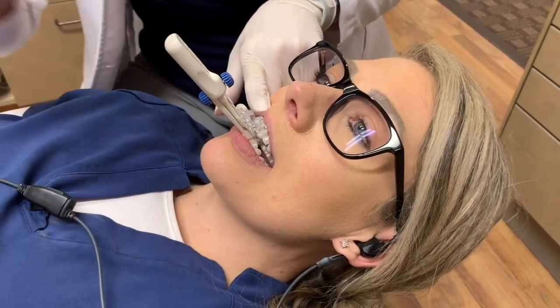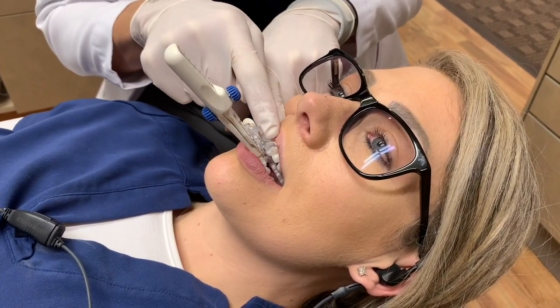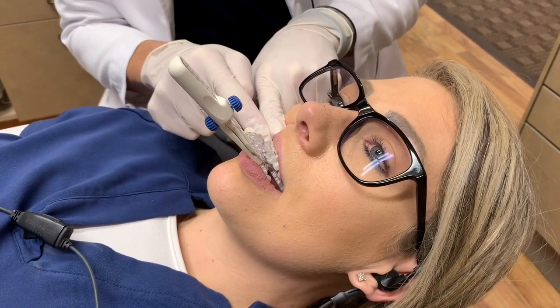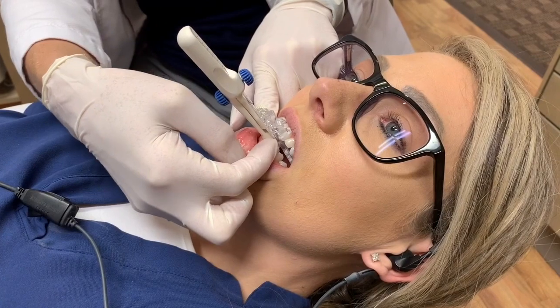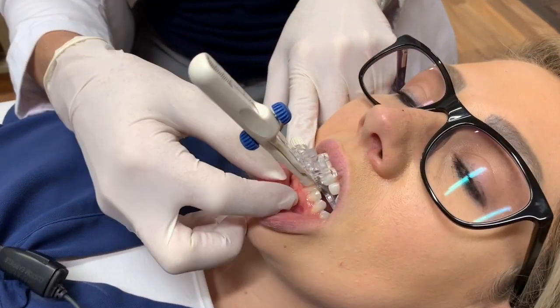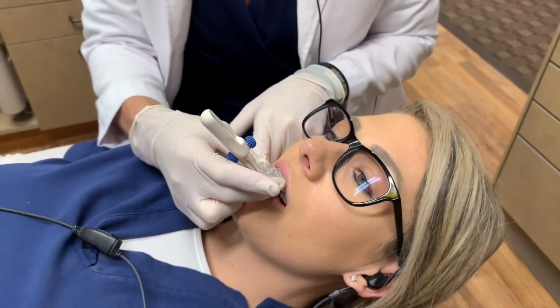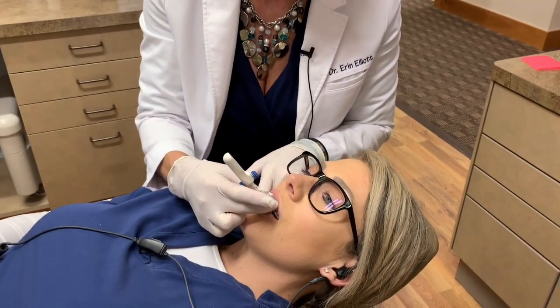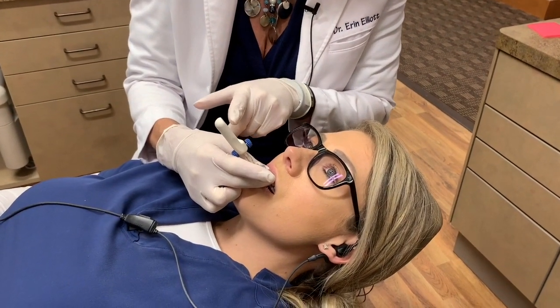I scoop the fork into the mouth and line it up. The midline here is midline to the face, not necessarily the teeth. I make sure the lower anteriors are all the way up, hitting the base of that gauge. Then I say: while biting down, go ahead and bring your lower jaw forward as far as you can go. And then I make the reading.